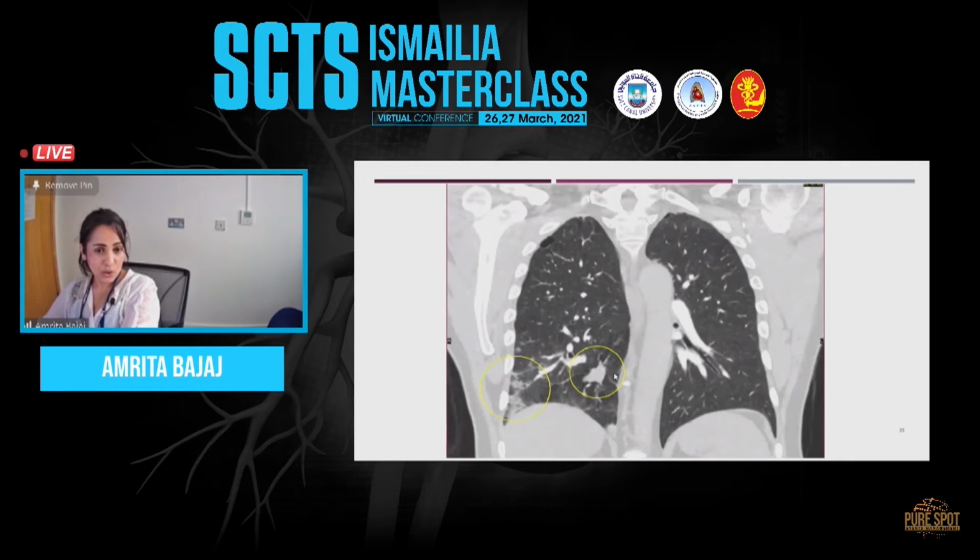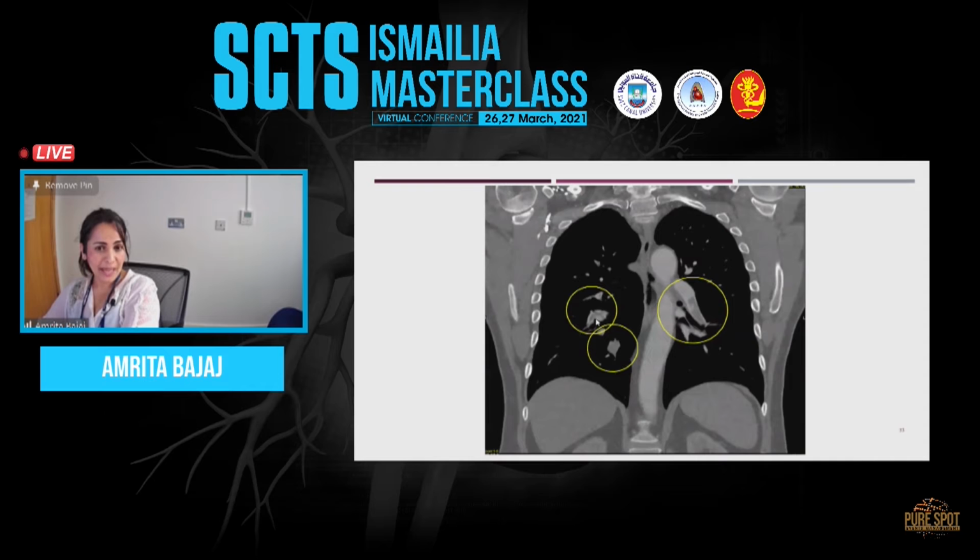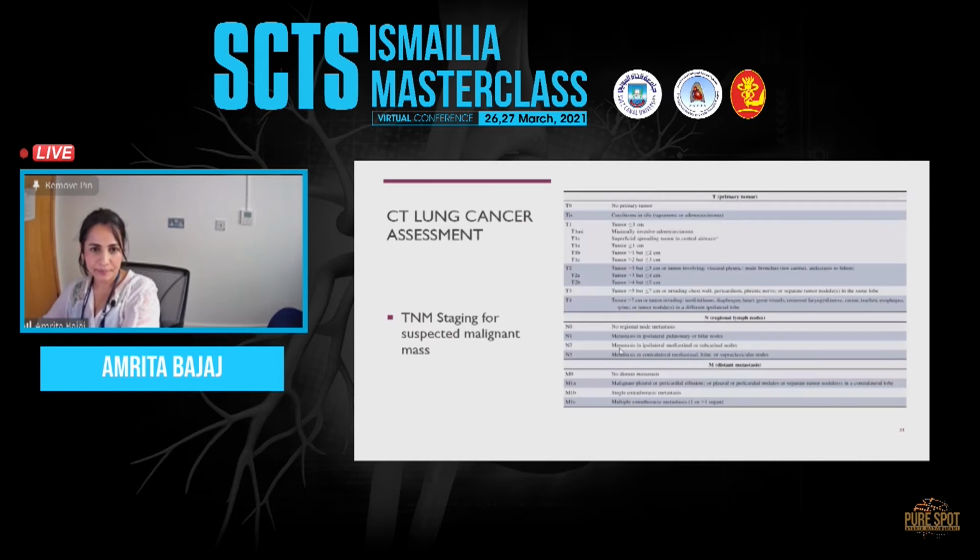This, in the same patient as this current one, was shown to be having multiple PEs, and yet this nodule was thought to be a bronchocele, because even though we see everything in gray, you can actually gauge the Hounsfield units, and that was thought to be negative and consistent with the bronchocele. So that brings us to the next thing. So what is all this about?